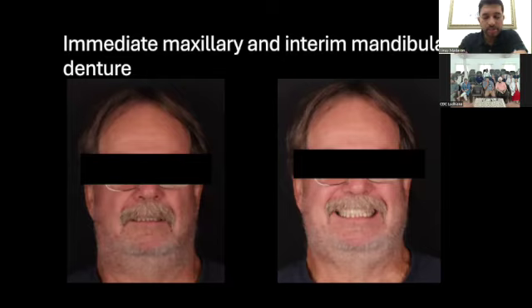And I know I discussed this in depth last time. In some patients, because the teeth are too proclined, you have to make too many modifications. In those cases, you cannot go to the surgery right away, so you have to do a teeth setup. In a patient like this patient who presented, I did not have to modify the incisal edge too much. That means I just had to raise it probably like a couple of millimeters. So you can guesstimate and then directly go into the implant phase if you were to do that.